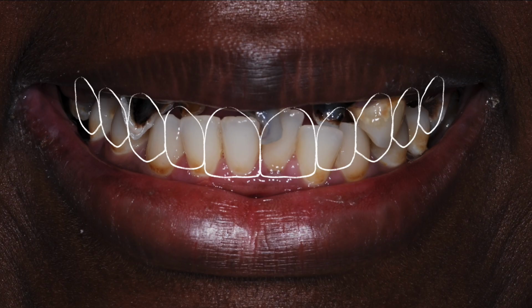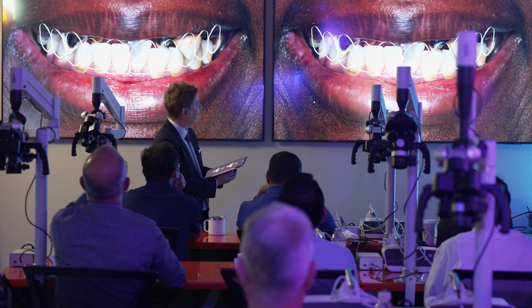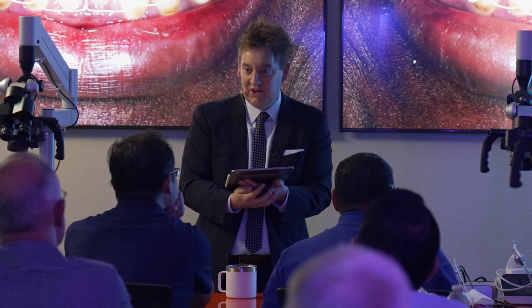So here's our patient. We all agreed that she had a terminal maxillary dentition. We've now established tooth position relative to her face. Now, how are we going to fit that with her mandibular teeth there? We're going to step on the rheostat. And we're going to start doing an alveolectomy.